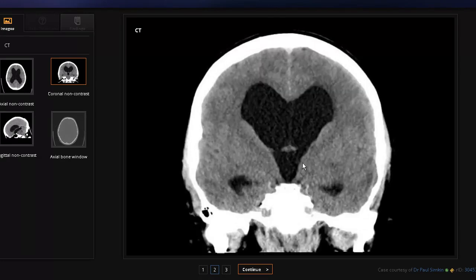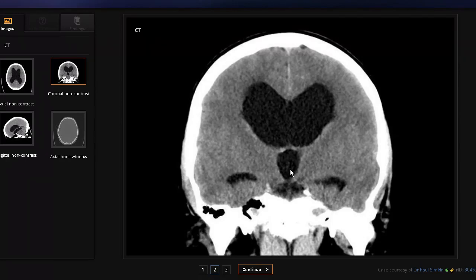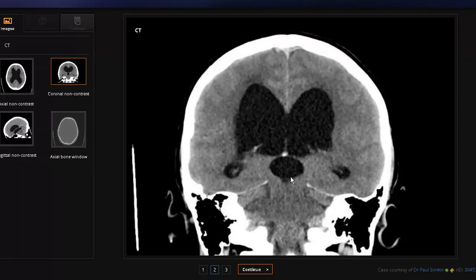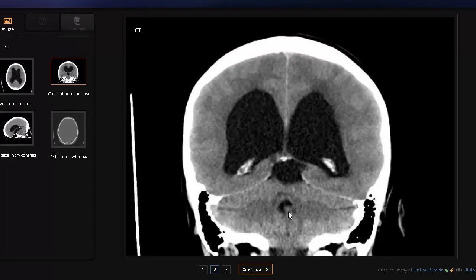Here you can see the interventricular foramen of Monroe — how the lateral ventricle communicates with the third ventricle. The third ventricle is also dilated; it's not usually this large. You can see the thalamus on the side forming the lateral boundaries of the third ventricle. Going further down, you can appreciate the cerebellum on the back. Here you can see the fourth ventricle, and it's quite normal with no enlargement.